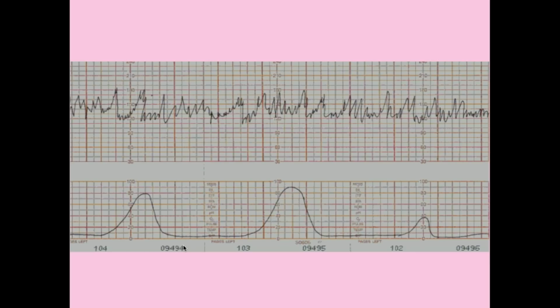Okay, so what is this? I'm just going to give you some strips here, and I want you to tell me what it is. Okay, so you see we have our contractions here, but really nothing going on with the contractions. So what's the baseline here? Pretty hard to tell. What kind of pattern is this? What kind of variability? This is marked variability. Note that we may have some accelerations here, but we don't really see them. But the variation, just going from one point to the next, you're hitting 180 relatively frequently. You're also hitting 110 relatively frequently. That's 70, a difference of 70 beats per minute. That is marked variability.